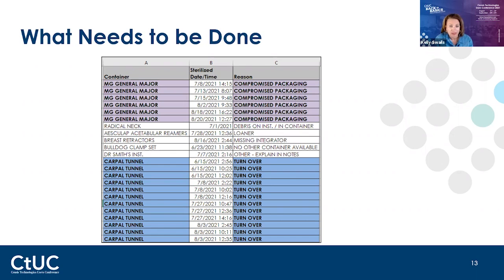And with that, then it was a quick, okay, do we go and not do as many eyes in one day? Do we divide that block up into 2 days? Or do we go purchase more instruments? And obviously we purchase more instruments because they're not going to turn away surgeries. And eye instruments are expensive. So it was not a cheap thing to do. But there again, we had to show Joint Commission, yes, we purchased the eye instruments. Here's how many sets we have now. So we took care of the issue.